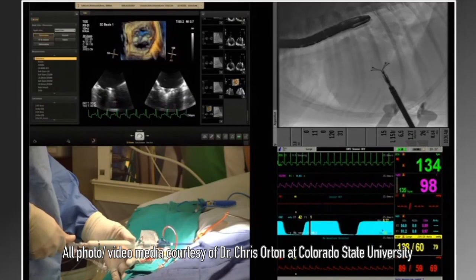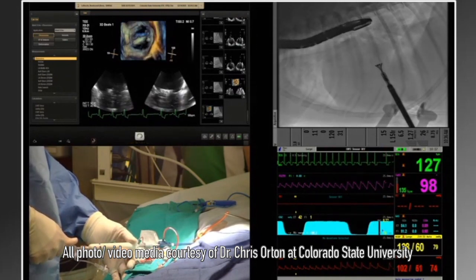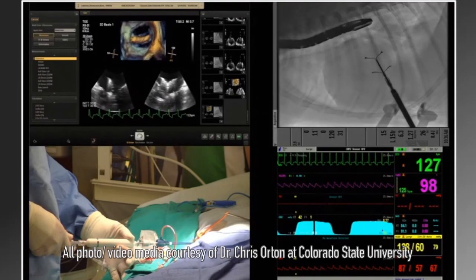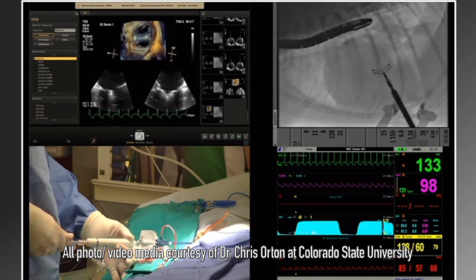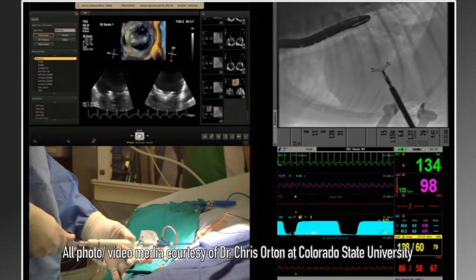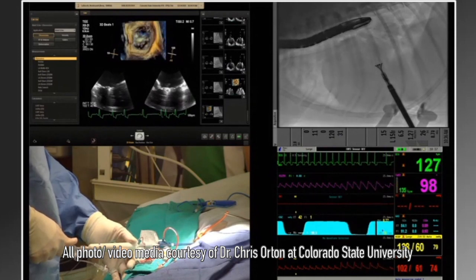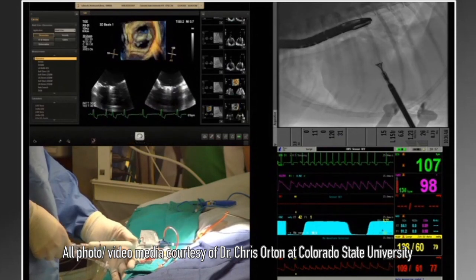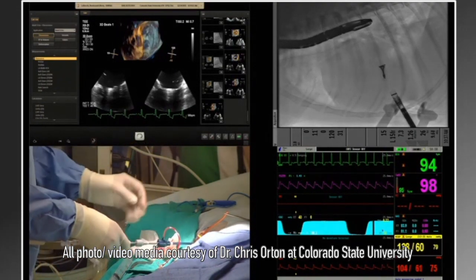When we do this technique, it's essentially a clamp. We go above and below the valve using imaging, grasp the valve, and then the clamp comes together and brings the two portions of the leaflet that are not meeting each other together. This creates a double orifice of the valve, which has been shown to be very well accepted. One of the remarkable things we see when we apply the clip is that the heart rate immediately falls and blood pressure goes up because the leak has been reduced.